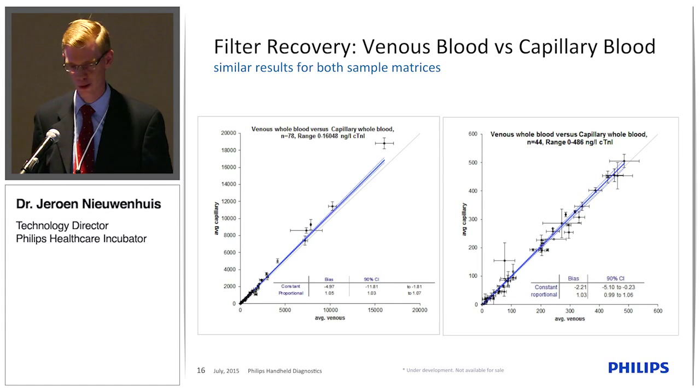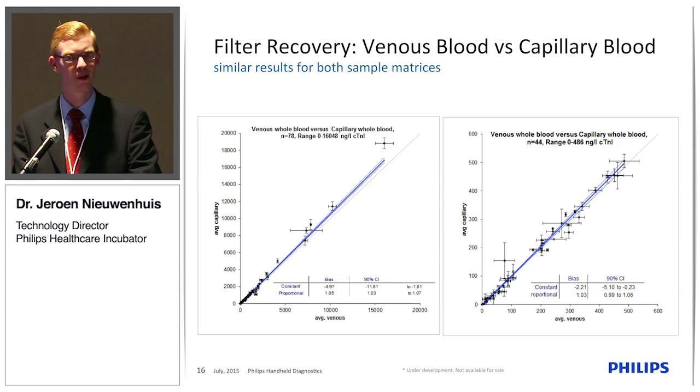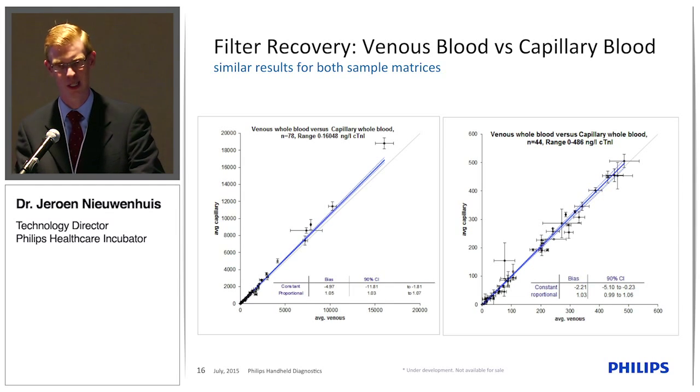We anticipate, of course, for troponin in the emergency department that the venous sample will be the dominant one, because as soon as the patient comes in, they typically draw a venous tube for reference values in the lab on a number of other markers as well. But it really shows the potential to get good results from capillary samples, also with quite sensitive assays. So we think it's very encouraging if we want to bring these tests out of the hospital, for example, to the rapid clinics or the physician office labs, and maybe eventually to the home for chronic disease monitoring.